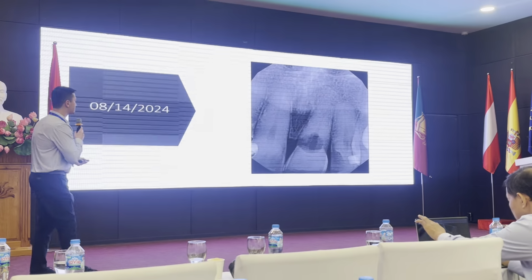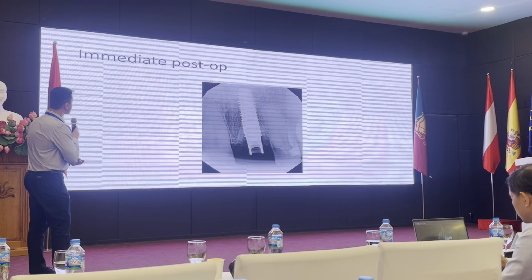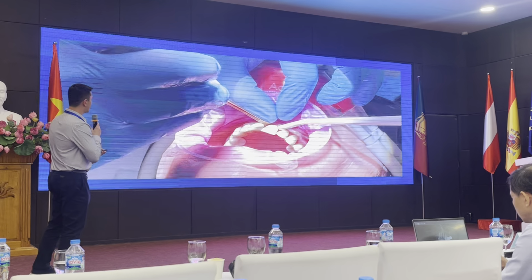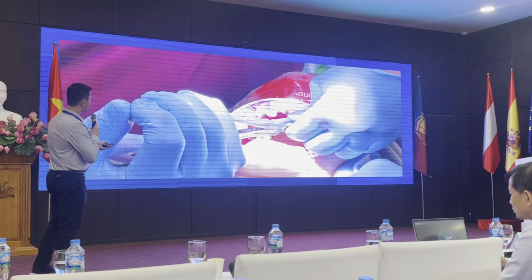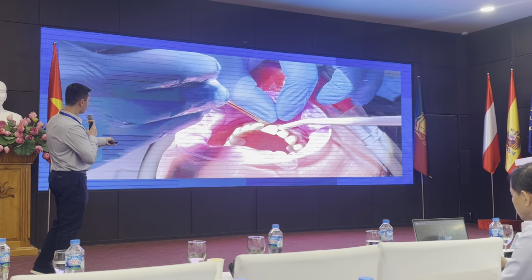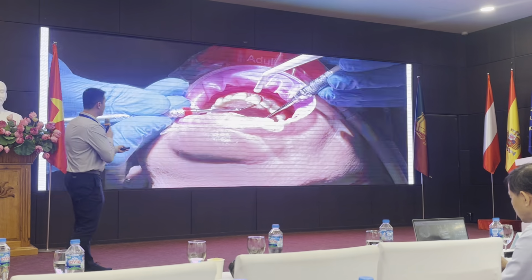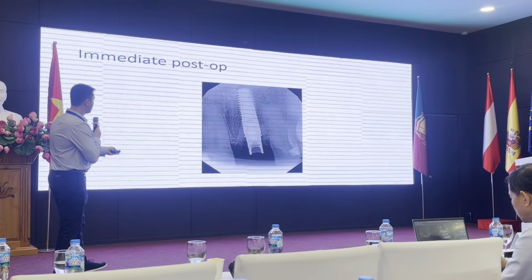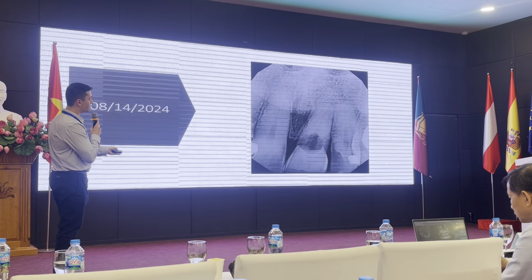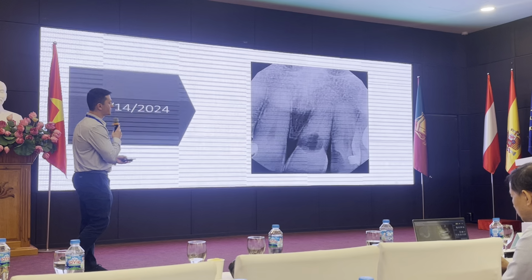This is the case we saw earlier, the external root resorption. So we'll go through this. So we already planned it. We removed the tooth. So same method here. I'm using the luxator right here, and we're just gently pushing around the tooth because there's very little tooth structure. So trying to remove this tooth without it cracking or breaking is very difficult unless you take your time.